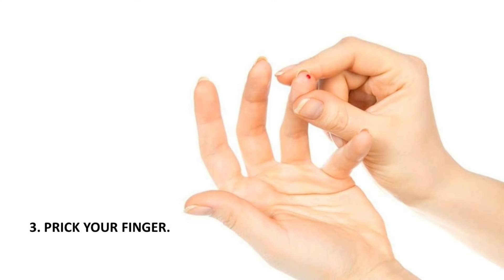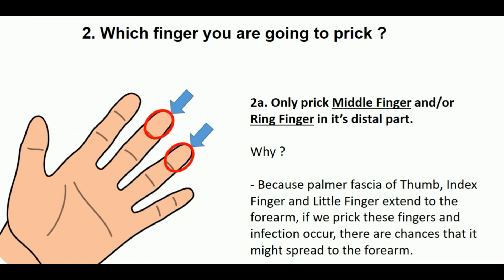Prick your finger. Which finger are you going to prick? Only prick the middle finger or ring finger at its distal part, as you are seeing in the photograph. Why? Because the palmar fascia of the thumb, index finger, and little finger extend to the forearm. If we prick these fingers and infection occurs, there are chances it might spread to the forearm.